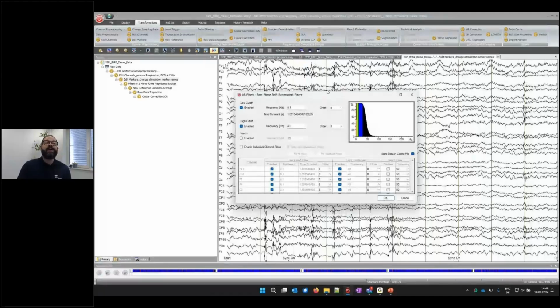Basically, the message is now that we have dealt with the MR artifacts, we have EEG data, and this EEG data might maybe be a little bit noisier than in our lab experiment, but still you could use now the same processing steps as for a lab experiment with the same paradigm.